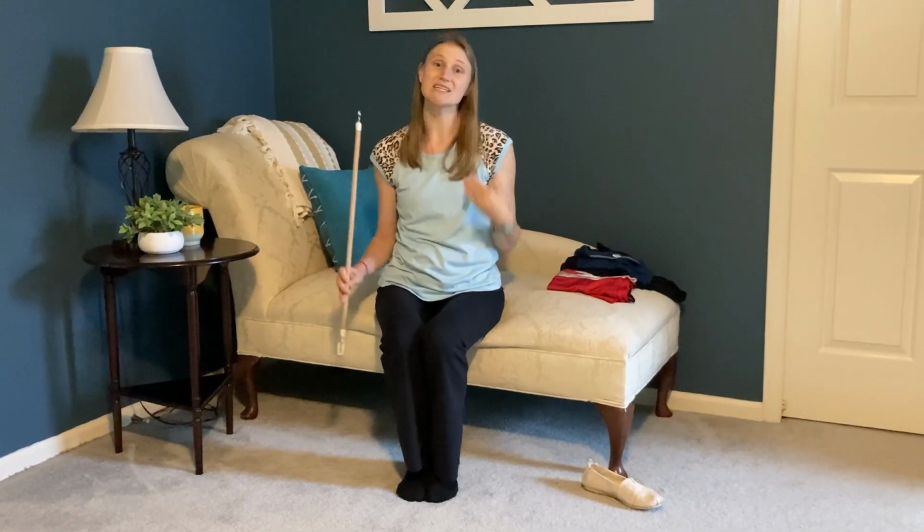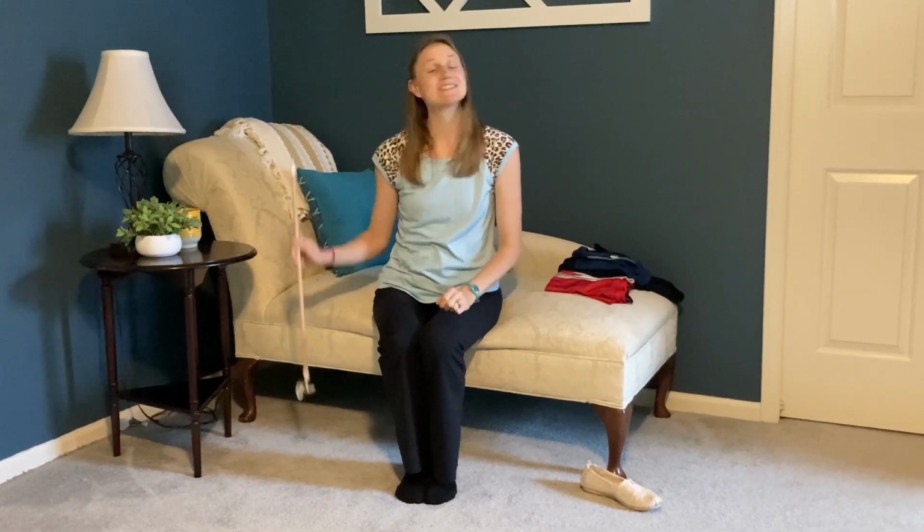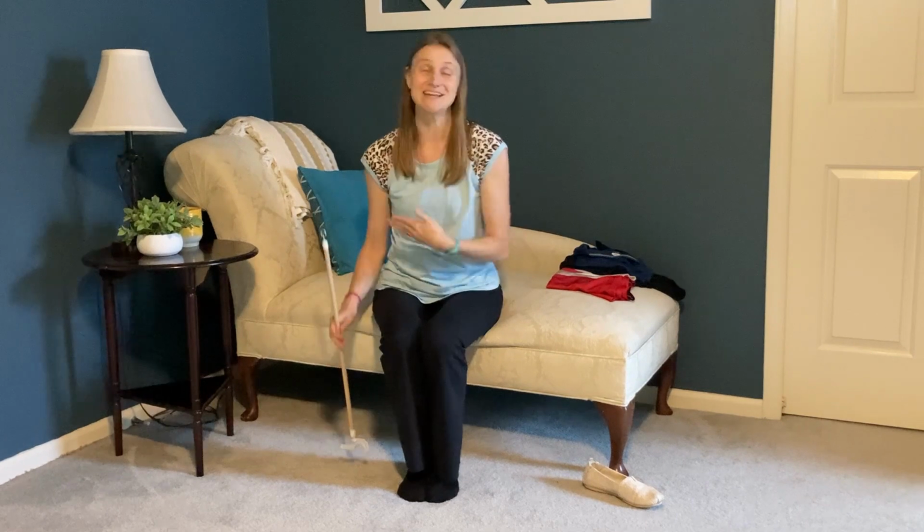So what I find this hook most helpful for is if there's an area in your house where you usually get dressed, if there's a hook on the wall or a rack next to you, you can simply hang this right next to you so that it's ready to go for next time, so that your dressing stick isn't reaching onto the floor and that puts you in a scenario where you have to bend down and pick it up.